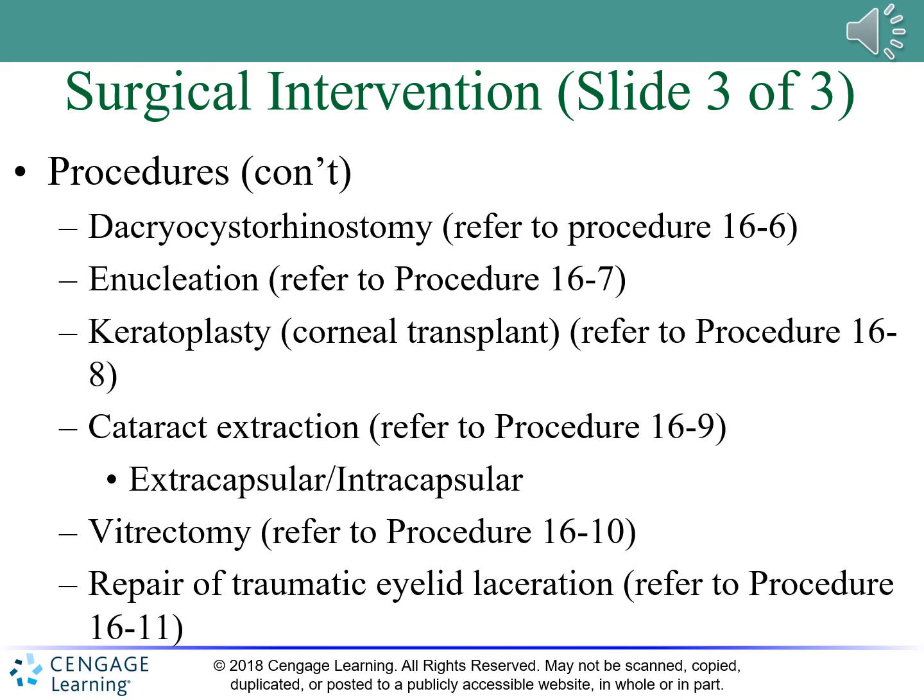Okay, and then there's silicone oil. This is sometimes used instead of gas to keep the retina attached postoperatively. Silicone remains in the eye until it is removed, which necessitates a second surgery. Then further down, unlike what they experience with gas, patients are still able to see through clear silicone oil.